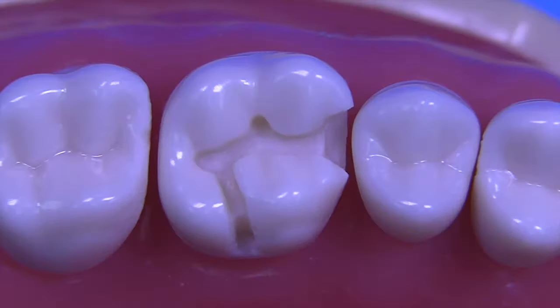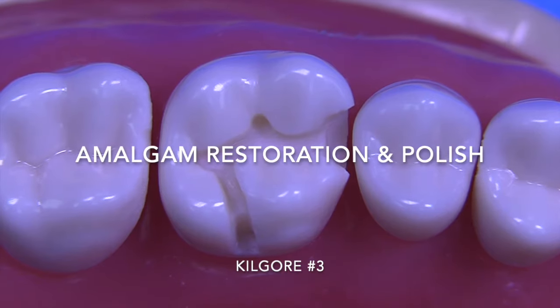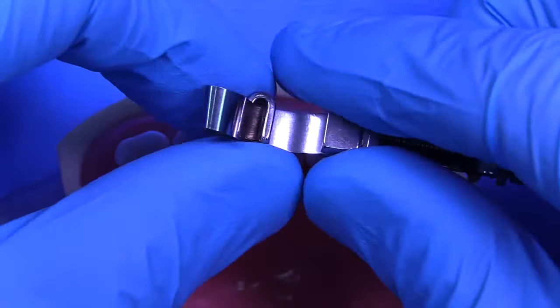Today we're going to cover the amalgam restoration and polish on the Kilgore No. 3 MOL. This was a prep done by one of our students. She did a really great job, so I said let me restore this.